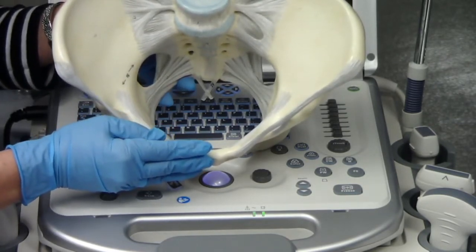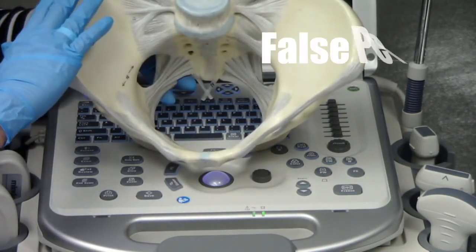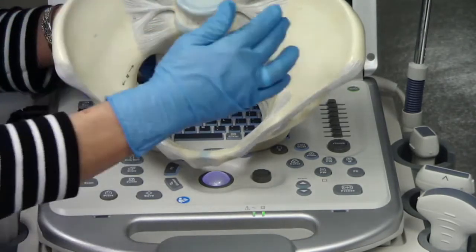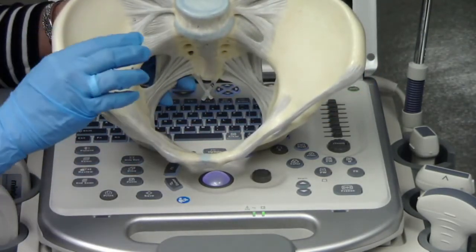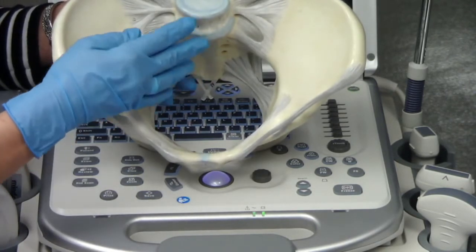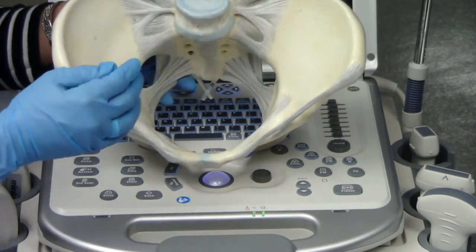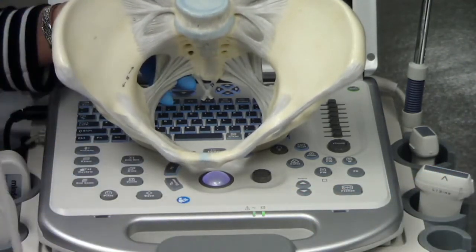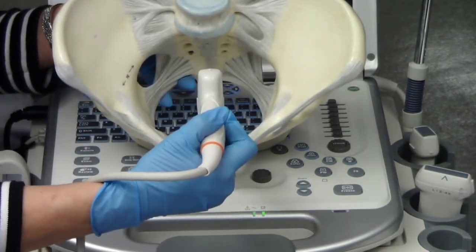When we put the probe up near the umbilicus, we're more aligned with the false pelvis, which is defined by the ala of the ilium. And your umbilicus is going to be about at the level of L4, L5. So when we place the probe, you have to consider too, there's a lot of overlying soft tissue that you have to press down against, right?